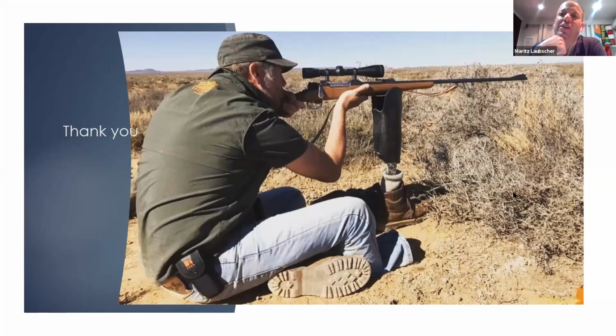Okay. And just a question earlier about a through knee amputation in trauma versus a short below knee versus an above knee. Is a through knee still a good choice? For sure, yes. We still prefer a through knee.